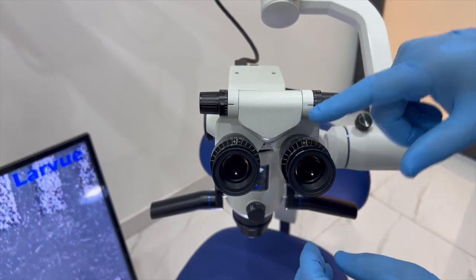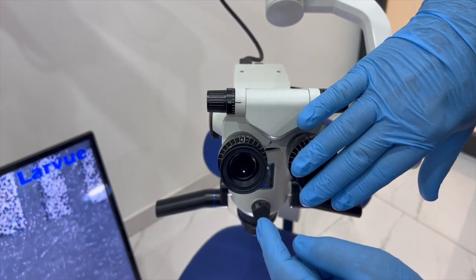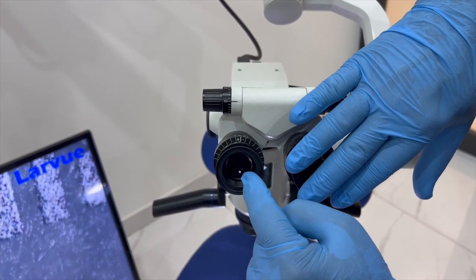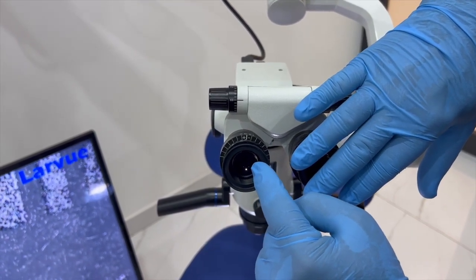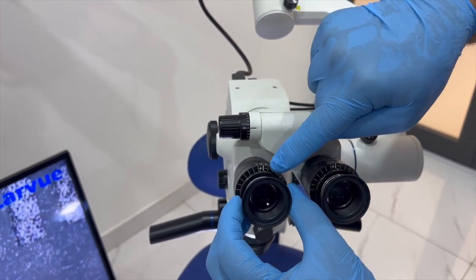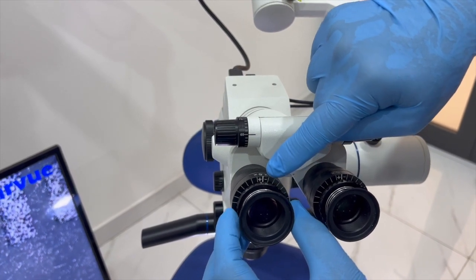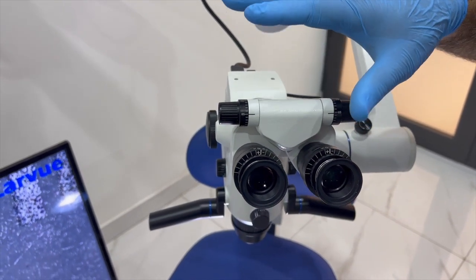Then leave it. Then jump to the next eye, which is the left one. Close the right eye. Look also at the picture. If you find a sharp image, that's okay. If you are not finding it, just play with the diopter to the right or left until you find the sharp image. Now the microscope is set.